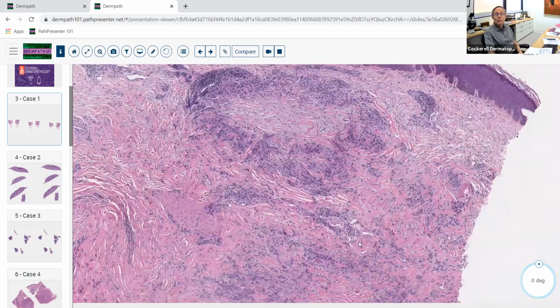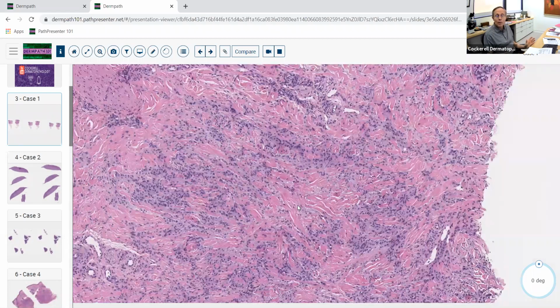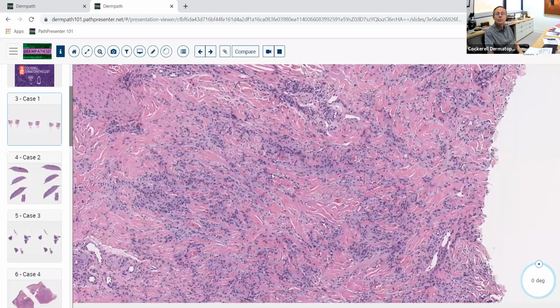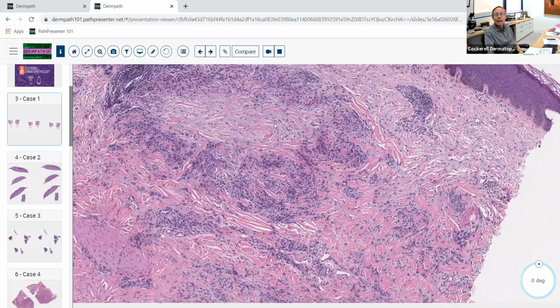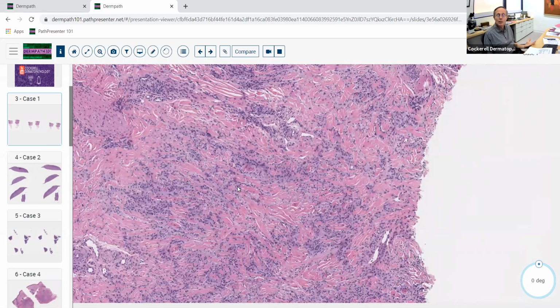Now, there's several different forms of granuloma annulare. There's the so-called interstitial form, mostly, where you get the histiocytes kind of splayed between, among collagen bundles. You get the nice ring of histiocytes like we see here. So this is a beautiful example of classic GA. And then you can get other subtypes of GA, like I mentioned before, the pseudo-rheumatoid nodule, subcutaneous GA. You can get perforating GA.